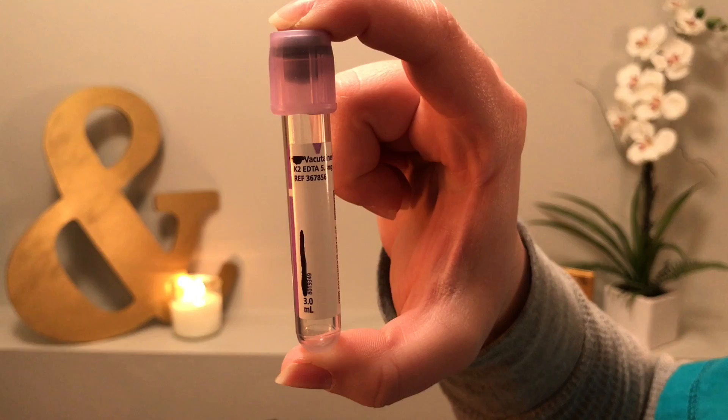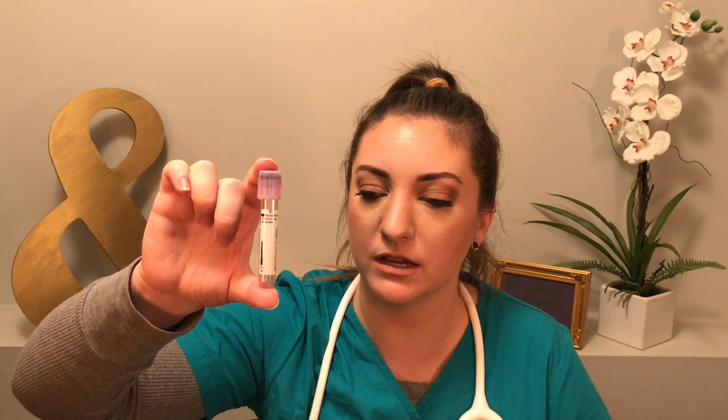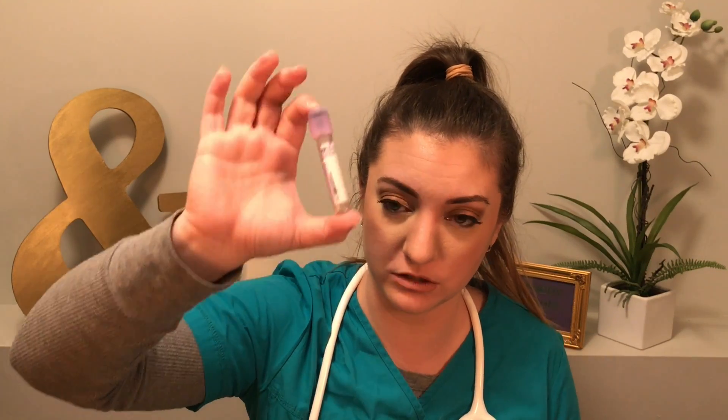The next one is called the K2 EDTA tube and it is a purple tube. With blood draws we use this mostly for complete blood counts and hemoglobinopathies — so any type of hematology study where we're counting actual blood cells, platelets, anything like that. It's very, very common. We just call it the purple tube because it's purple.